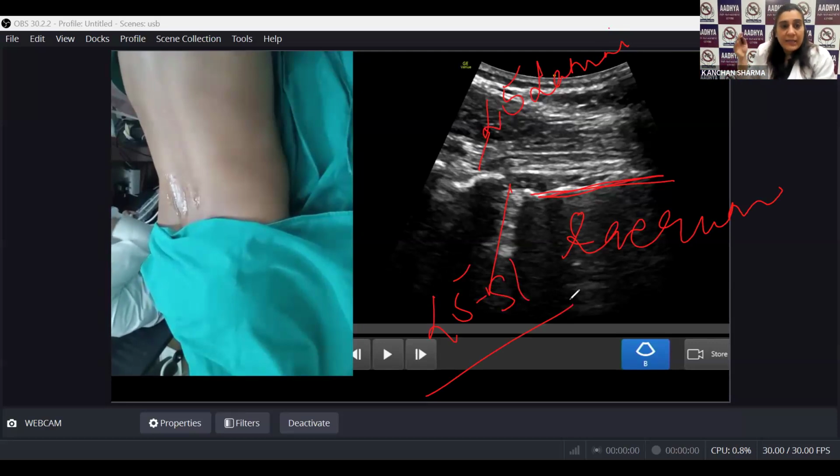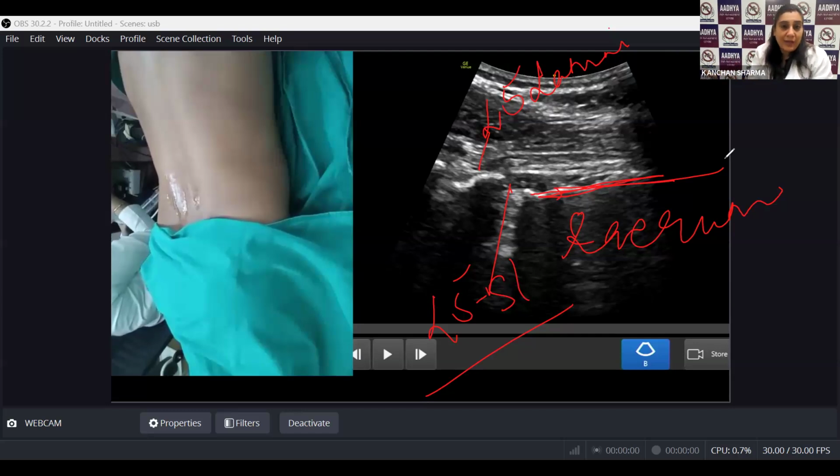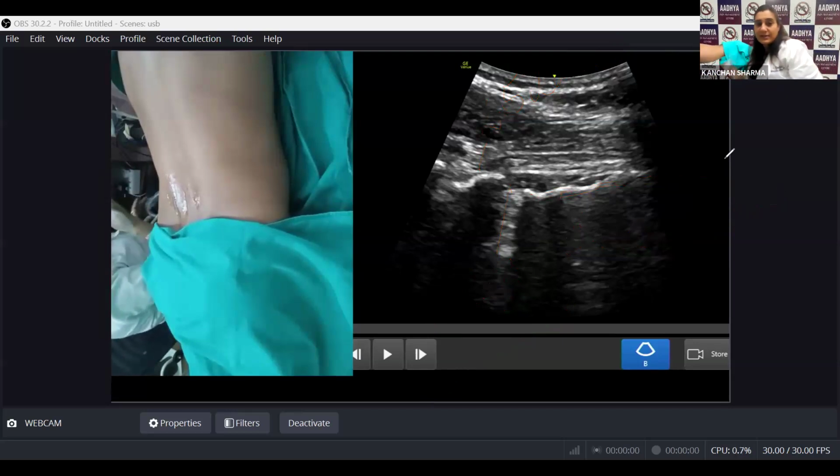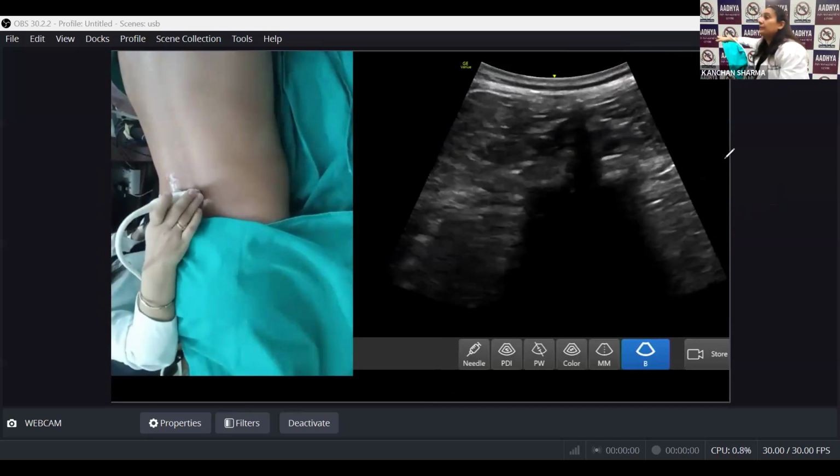Okay, you see the horse head, keep on going distally until you see this straight line. So this straight line is going to be your sacrum. It is no longer like a horse head. So your lamina of the lumbar region will have a typical appearance of horse head, which neither your cervical spine will have, neither your thoracic spine will have. Do remember this. This is very important. Only horse head view, you see it in the lumbar spine. And once you are moving down, you will get a flat line. Flat line means you have reached the sacrum. Then you can just count the spaces. And the spinous process, I'll show you with the linear probe. We'll finish the spinous process view and the interspinous, and then we will go to the linear probe.